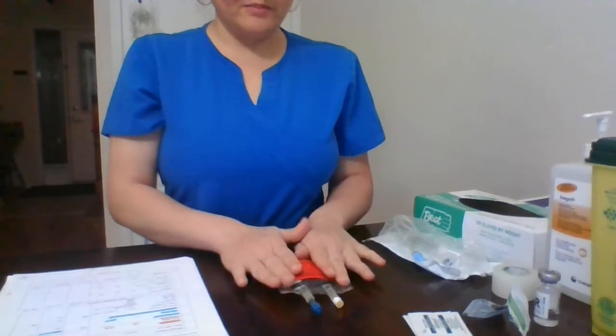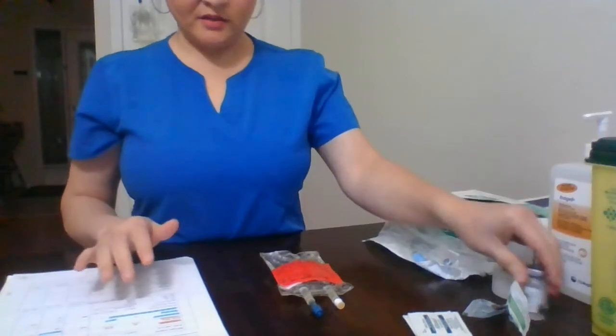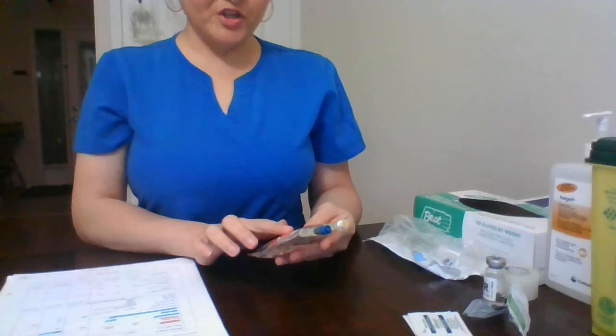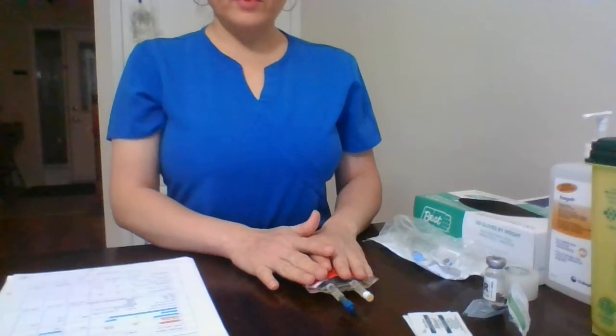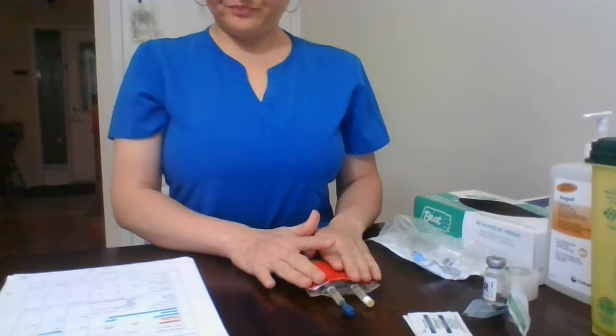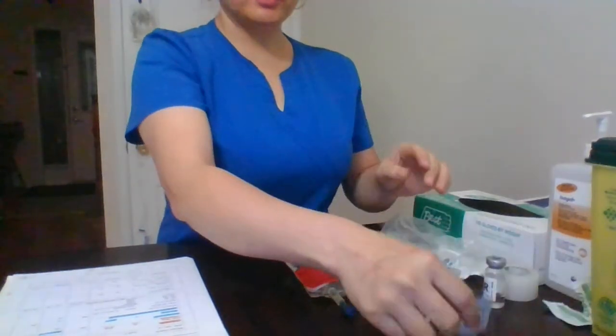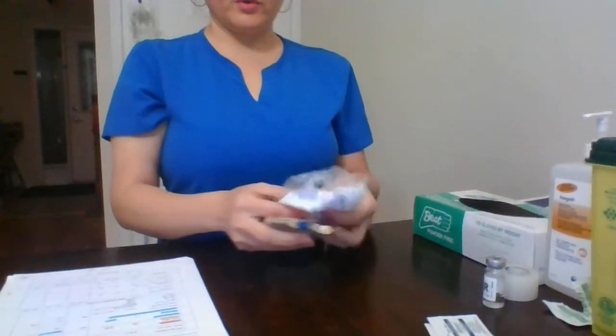And once again, we will compare our medication with our MAR. So we have 3 ml pantoprazole, 3 ml, and our patient is Mr. PNL. Okay, so now we have already added our medication into our mini bag. So the next thing we will do is we will go to our patient's room with a few alcohol swabs and our port.